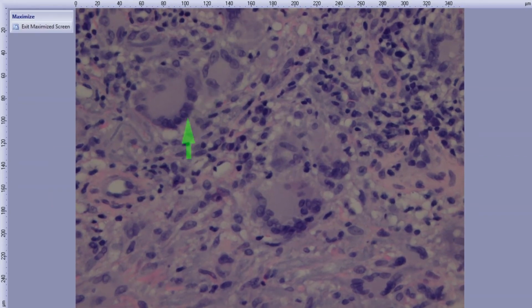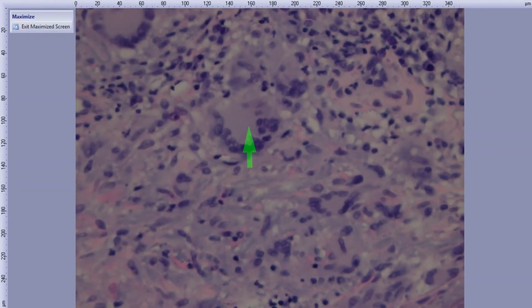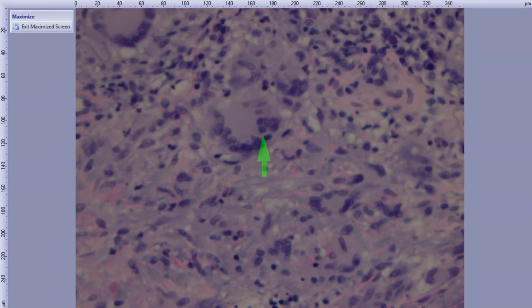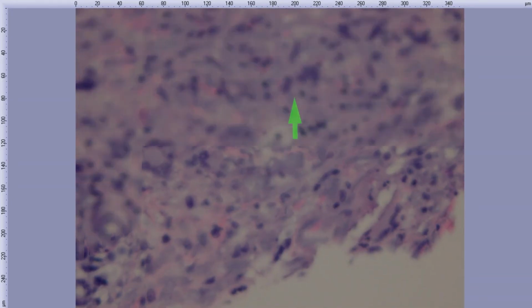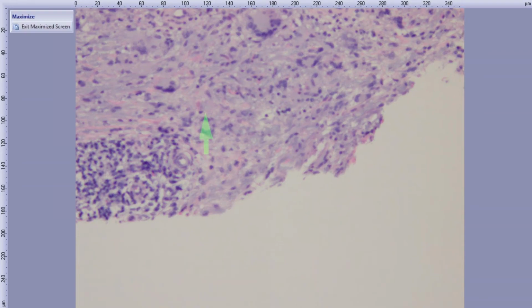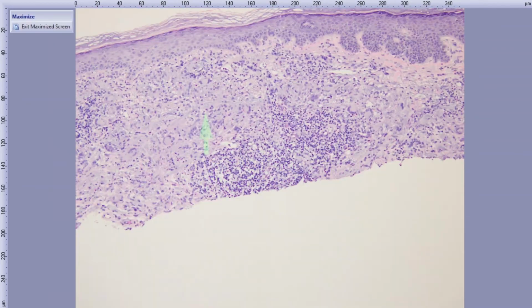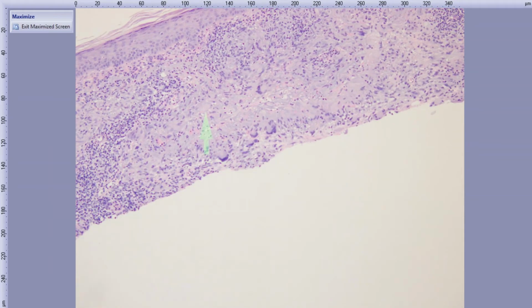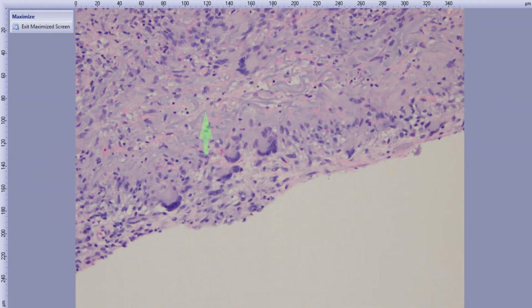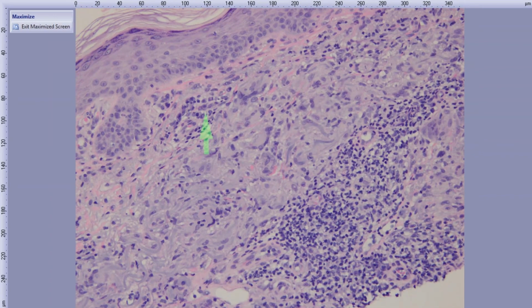It's starting to make you think there's a little vacuolated periphery, and these are similar in that you've got this central area with the rimming of the nuclei, but here you've got some where the nuclei are just mixed up and not in that pattern. I've got to give it to you on some of those. They do look like Touton giants.